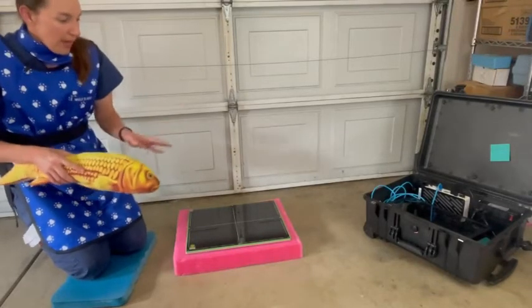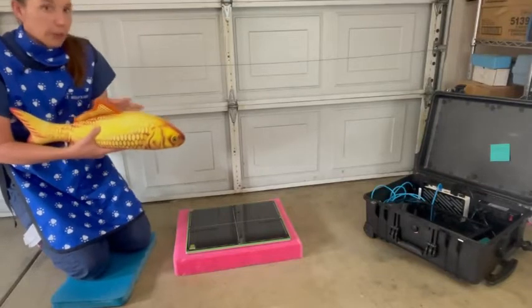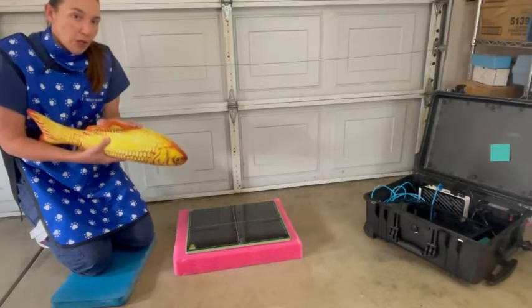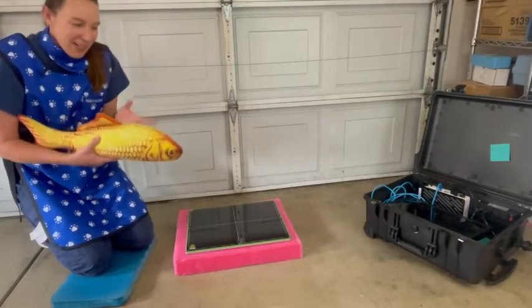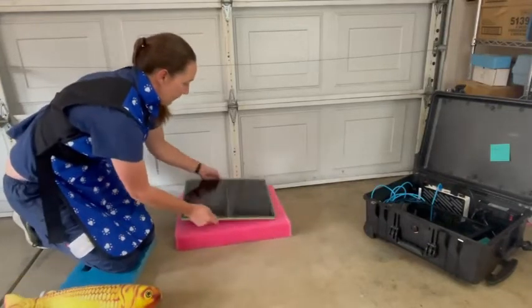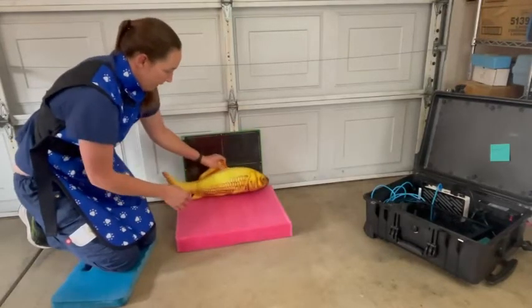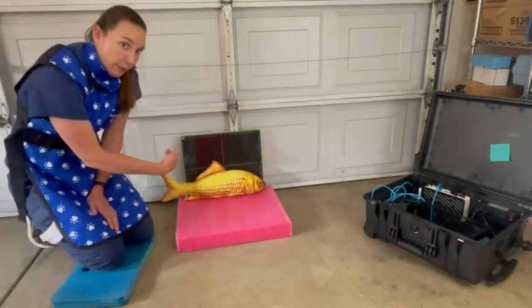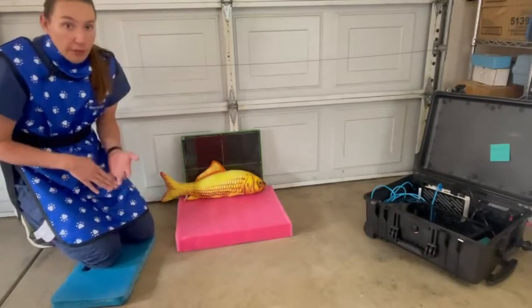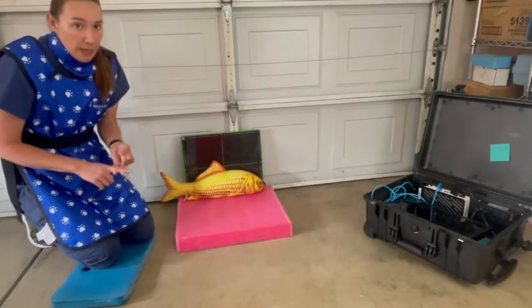Obviously a big fish is already asleep. Once we have the dorsal-ventral, we're going to be doing a lateral. For most fish we're actually going to do what's called a standing lateral — where we actually shoot the radiograph perpendicular through the fish. This is very important with fish because with radiographs and x-rays the most important structures we're looking at are the swim bladder and the spine.